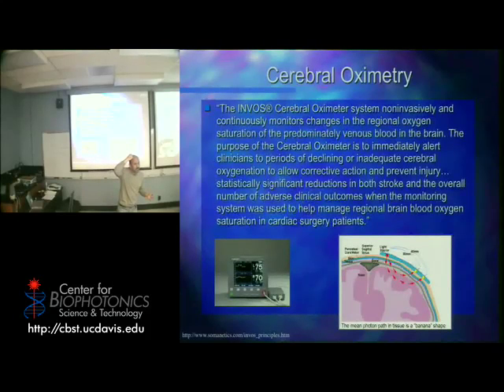Red and near infrared. That's what we use for pulse oximetry. They can pass it through your brain and effectively tell whether in that portion of your brain there's fresh blood.